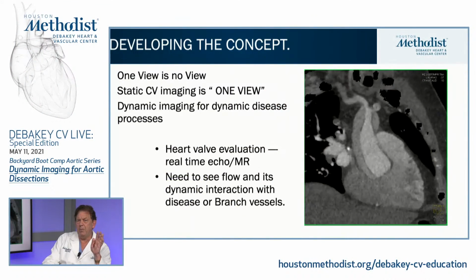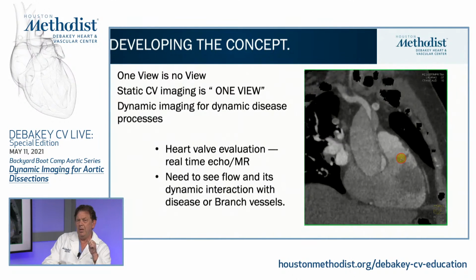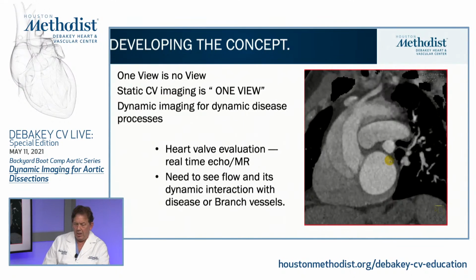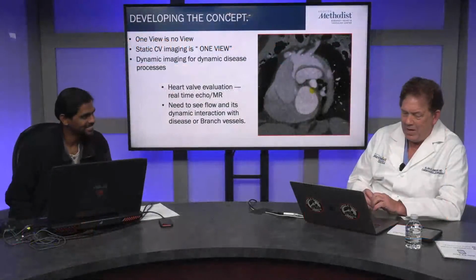And so this is going to be used as our segue. This is a type A dissection. Ponraj is going to go through this in particular, but it's just to show you how dynamic these structures actually are. So, Dr. Chinnadurai, I'm going to hand this off to you. Thank you, Dr. Work your magic.